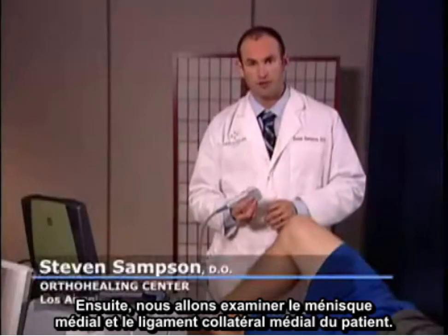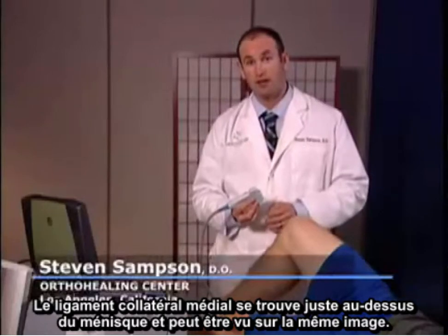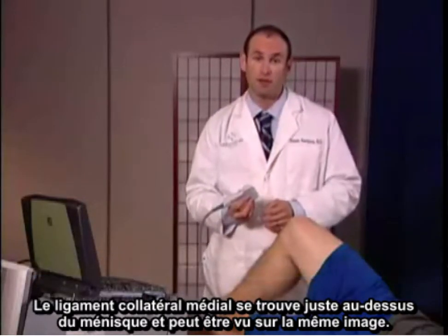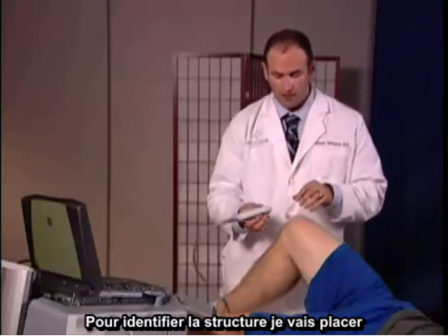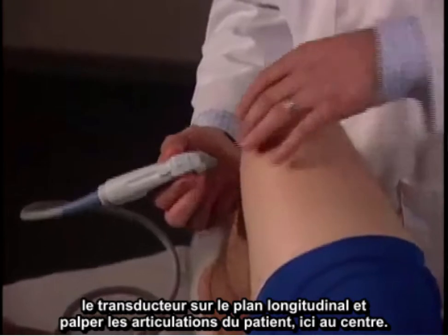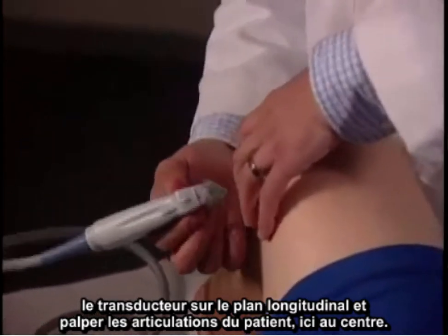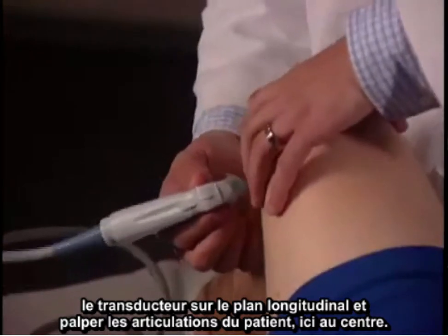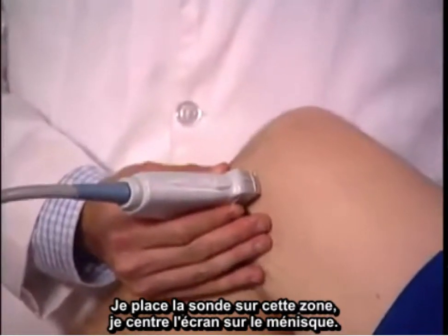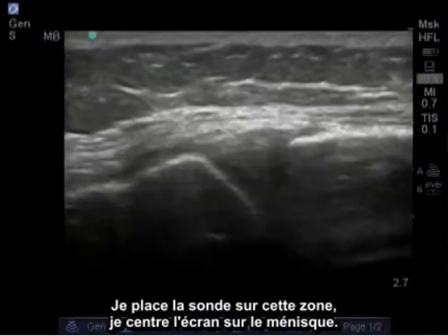Next, we're going to examine the patient's medial meniscus and medial collateral ligament. The medial collateral ligament lies just on top of the meniscus and can be seen on the same image. To identify this structure, I'm going to place my transducer in the longitudinal plane and palpate the patient's joint in the center, place the probe over that area, and center the meniscus in my screen for viewing.